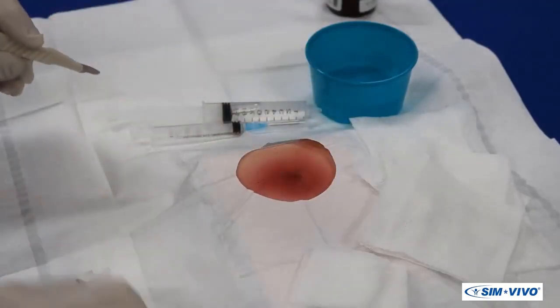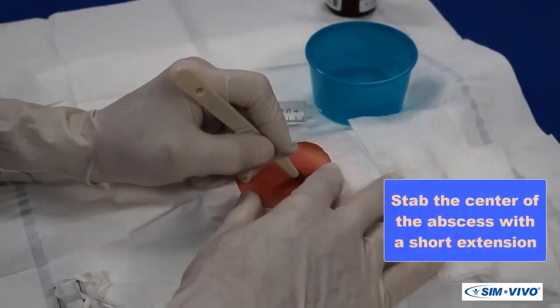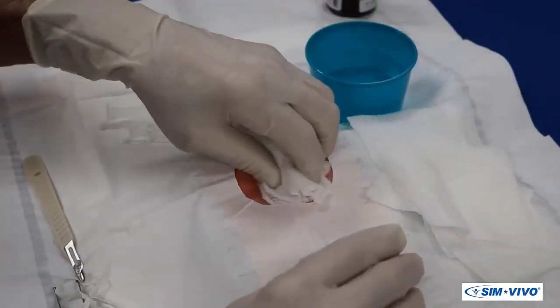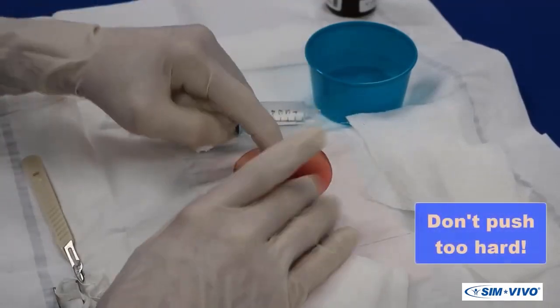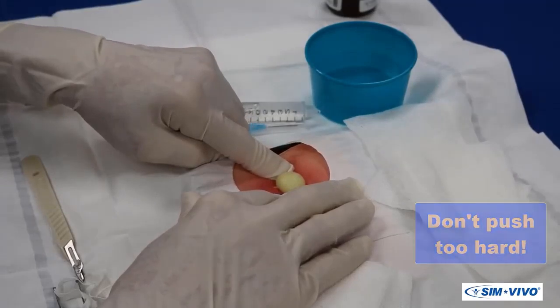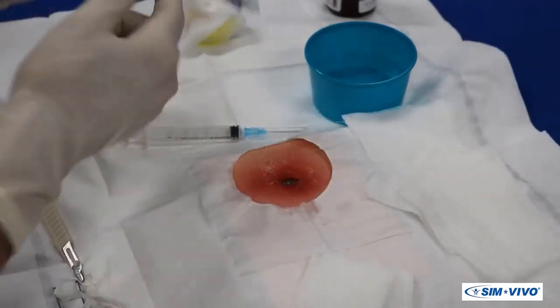Now it is time for the incision. In most cases, the incision will need to be large enough to allow complete drainage and prevent the early sealing of the skin. Hold the scalpel like a pencil and stab the center of the abscess, followed by a short extension. Wipe the purulent material away with four-by-four sponges, and gently compress the skin around the opening to evacuate more pus.